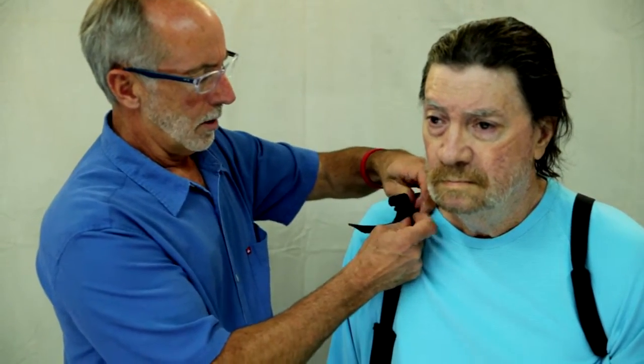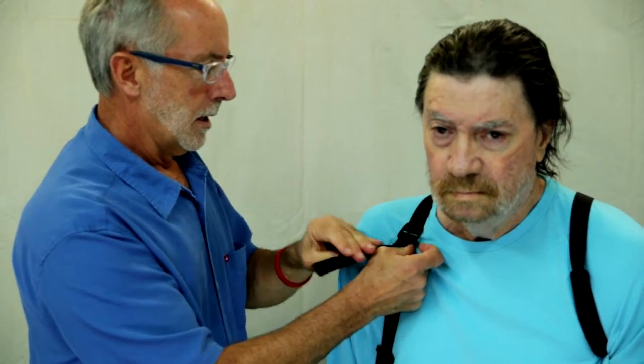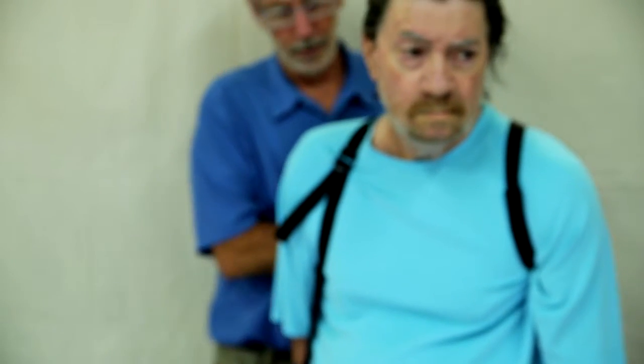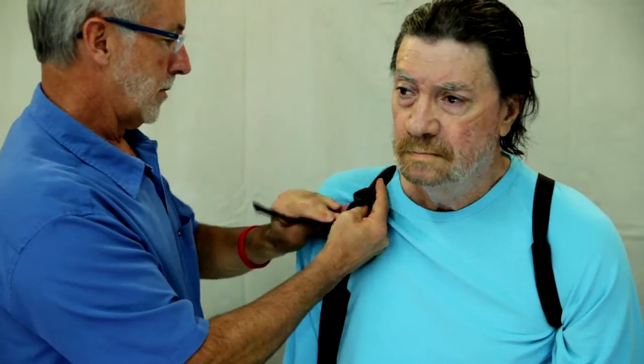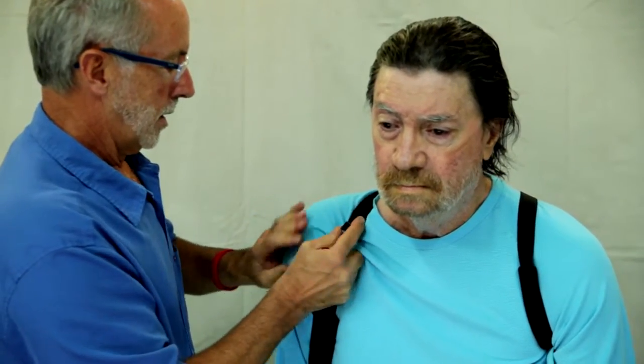We tighten up the buckle, and we really want to keep the elbow bend less than 30 degrees. I'm just tightening the buckle in the back — sorry you guys couldn't see that. We'll tighten this one up a little bit more. And now you can see that there's just a hint of a subluxation there, so let's tighten it up just a little bit more.